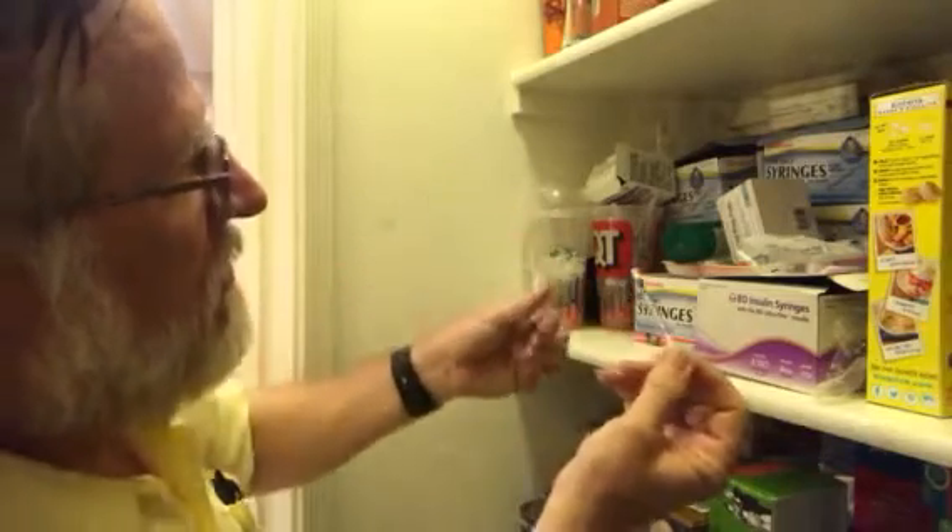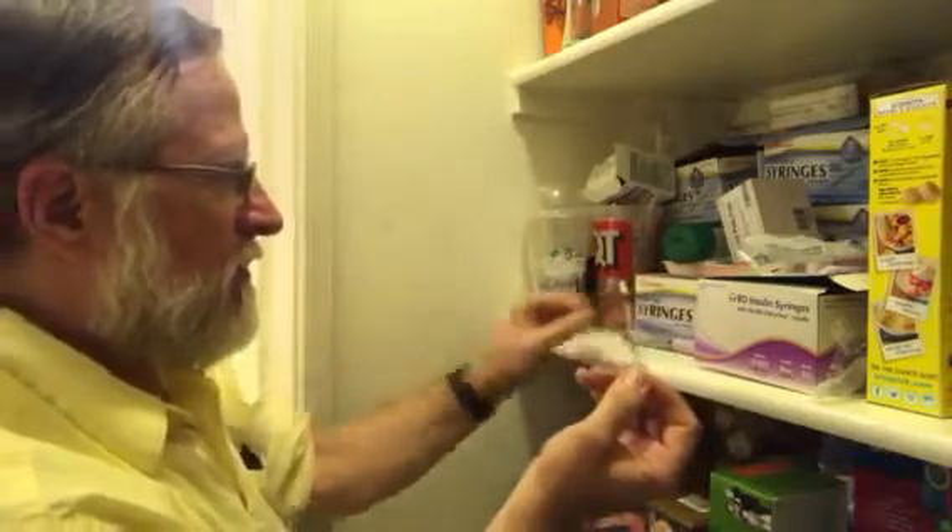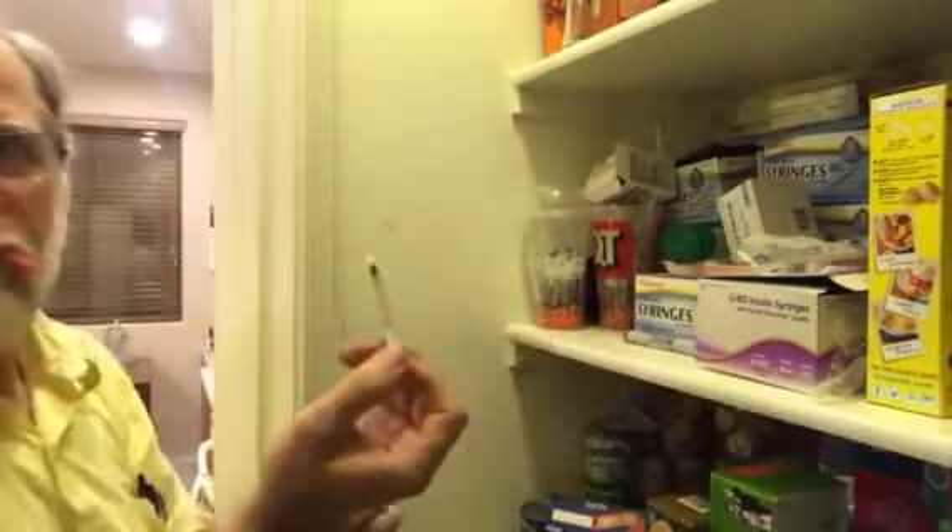And then pull that out. We can put that back, put the cap back on there. And then we can go and give it to the kitty.